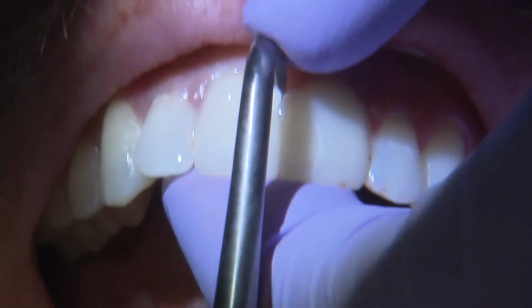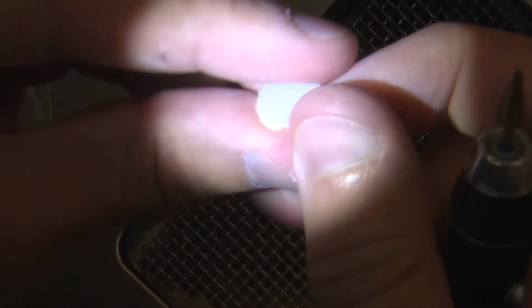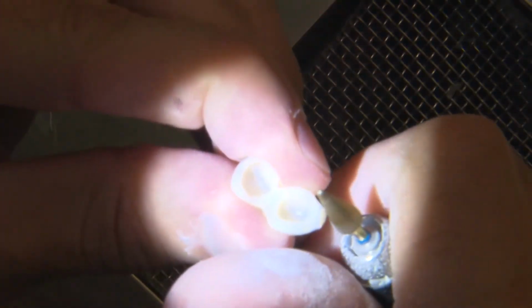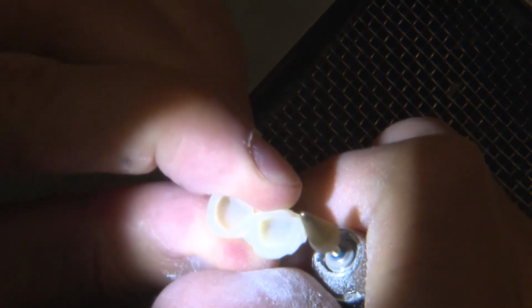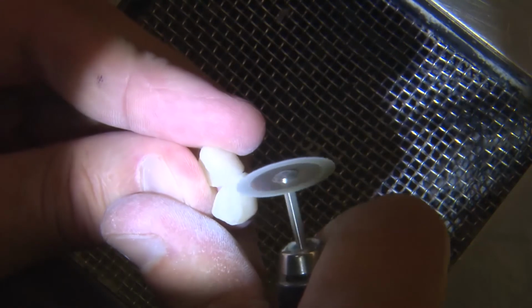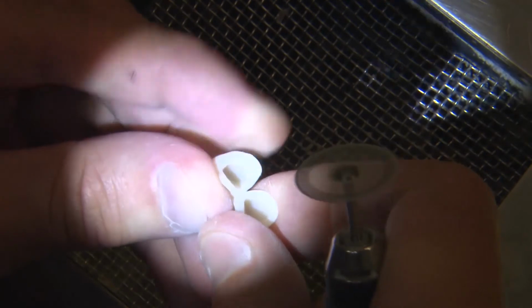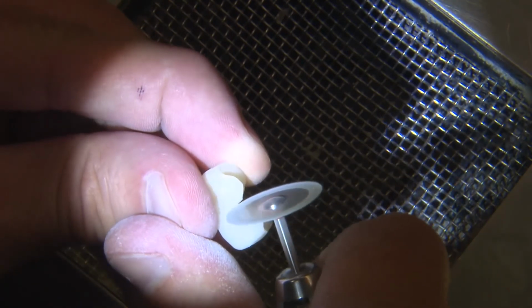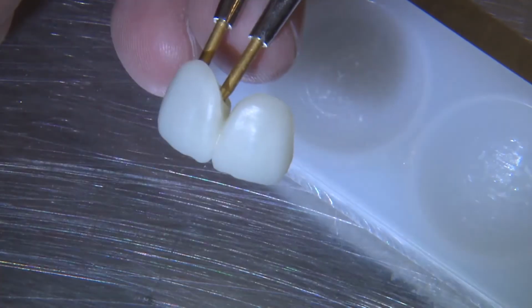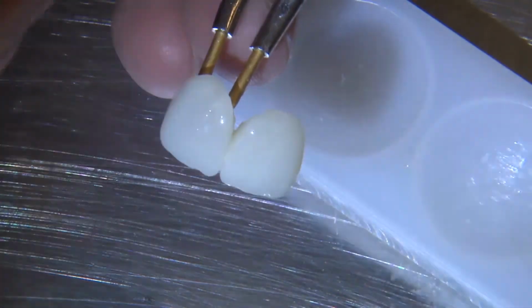So once the material is set, I'll go back into the laboratory and remove the excess temporary material, and I want to make sure that my margins are as crisp and clean as possible. So I'll use diamond discs and some lab burrs to make sure that I have enough opening approximately between teeth number 8 and 9, and also nice and clean margins. So once my temporaries are completely fabricated and finished, I can go ahead and apply some Palaseal to provide a final glaze, and then I want to deliver the BioTemps to the patient with some temporary cement.